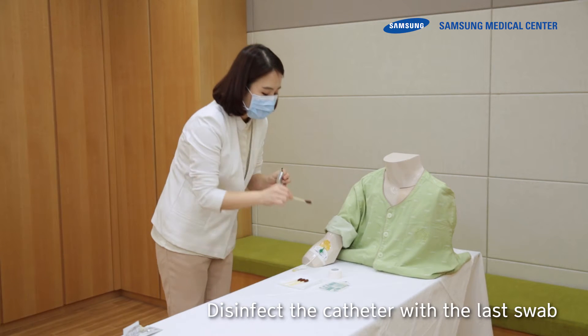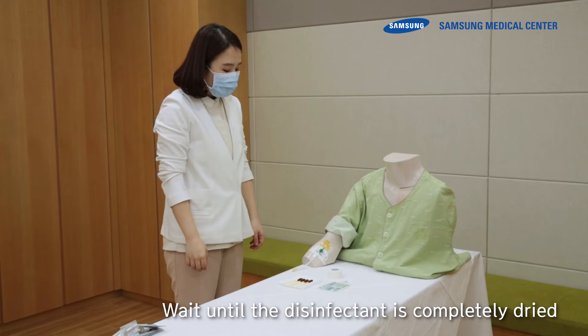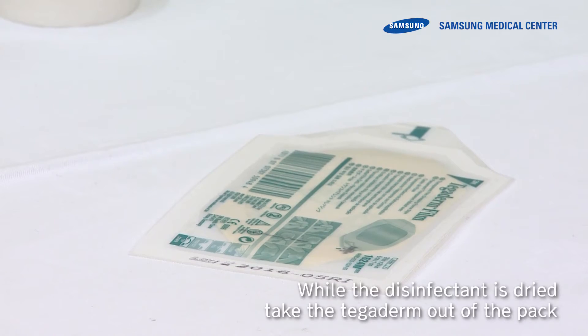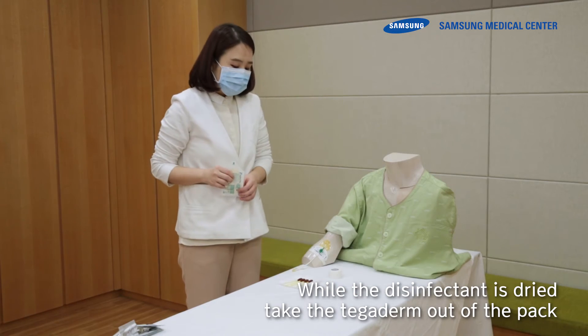Disinfect the catheter with the last swab. Wait until the disinfectant is completely dried. Do not blow it by mouth or fan. While the disinfectant is drying, take the Tegaderm out of the pack.